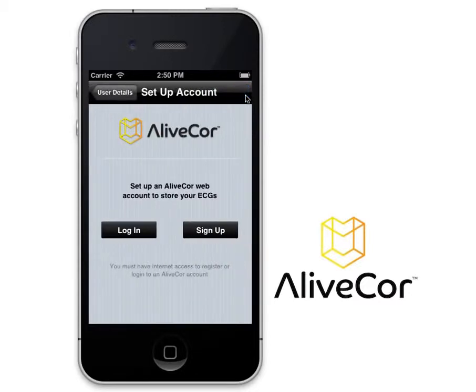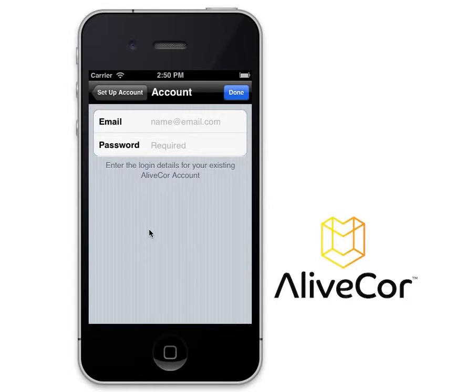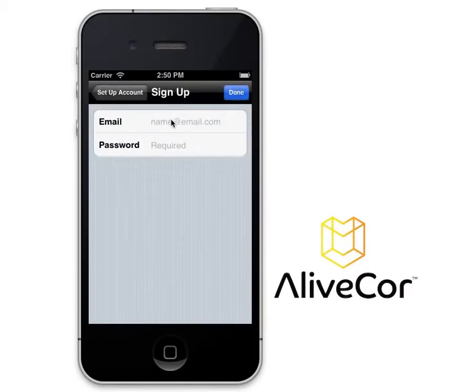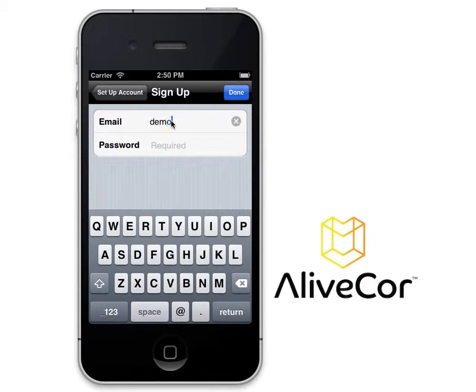Then, you will be asked to set up an AliveCore account. If you already have an AliveCore account, you may tap Login at this time and enter the email address and password associated with that account. If you do not yet have an AliveCore account, tap Sign Up, enter an email address, and then create a password to use with this account.